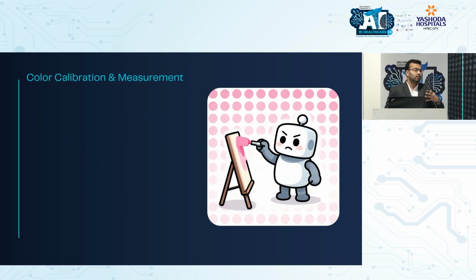So color calibration, I'll just summarize this. Like in biochemistry we have a calibration, like 1 is equal to 1 and the machine is supposed to measure that. Calibrations are also available for different scanners, where the entire spectrum of colors that is there in an H&E slide is fed into the scanner and says that, okay, this color is equal to this. So that is how you calibrate your scanner. Most of the scanners these days auto-calibrate, and that's how you get your image clarity. So when you scan images continuously and you see that it's fading out a little bit, at that point of time, you need to recalibrate it, or you talk to your service provider.